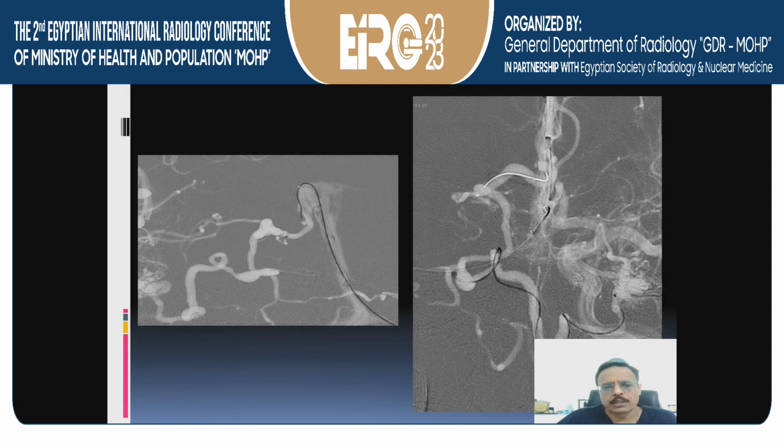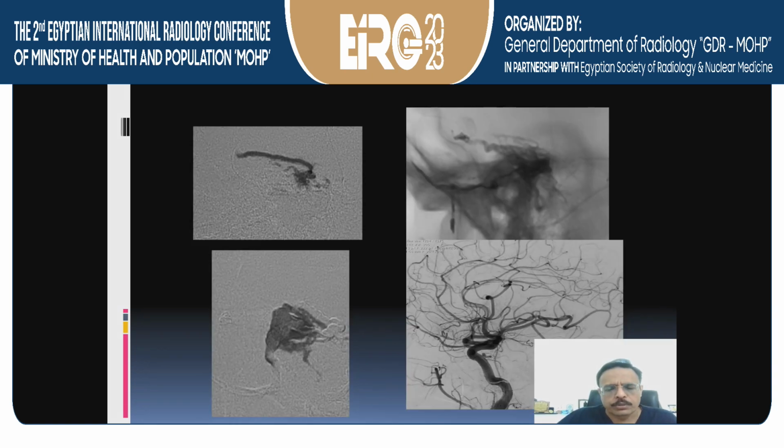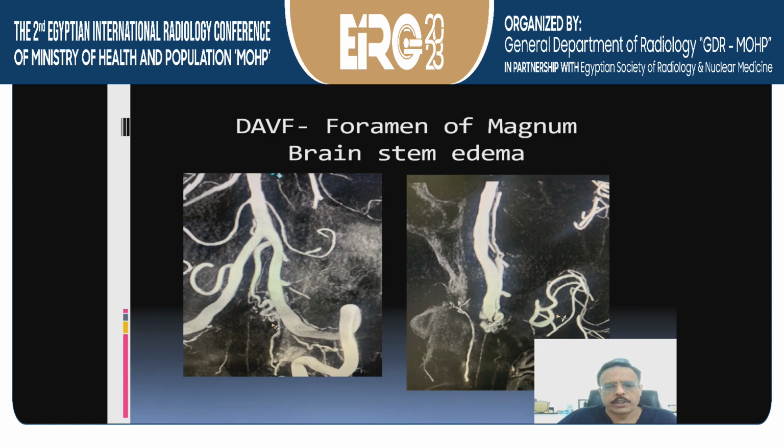This is from the occipital artery. So we went through the straight sinus retrogradely into that vein, and then we could catheterize that complete vein to reach the stump here of the vein. And then once you do Onyx injection, you can control the liquid material so that a segment of vein is occluded. Then retrogradely, we could inject the whole of the AVM to get a complete occlusion.